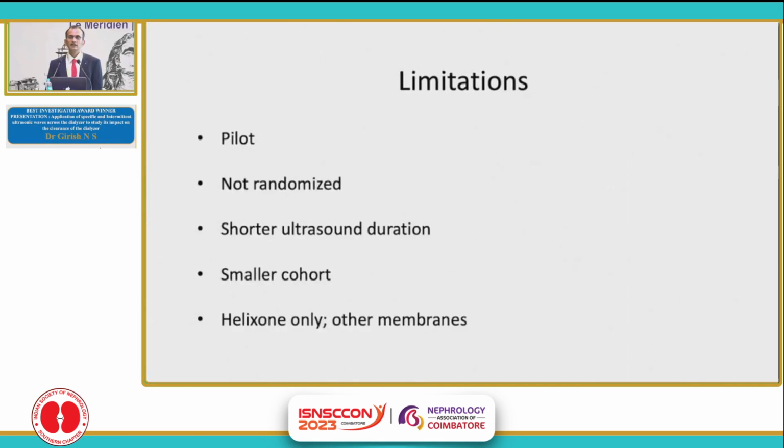The limitations of our study: it's a small cohort pilot study. It's not randomized, and retrospectively thinking, I think we have used a shorter span of ultrasound waves compared to what we could have used, and we have restricted ourselves to just the use of ultrasound on Helixone membranes only.